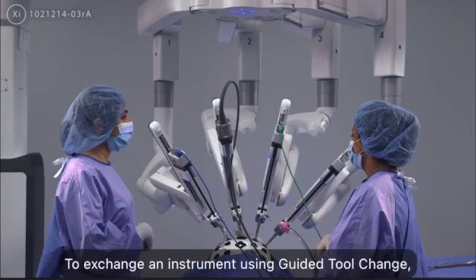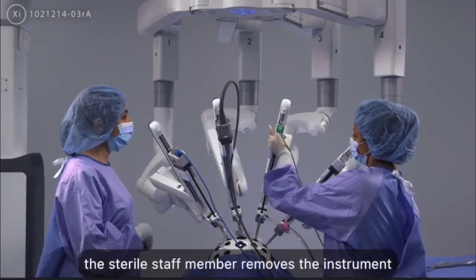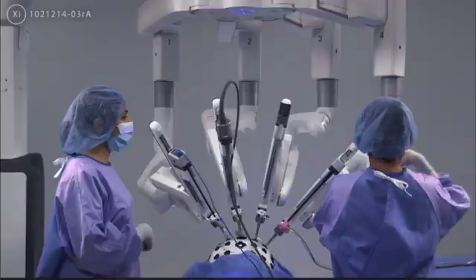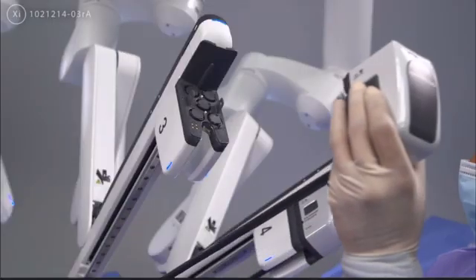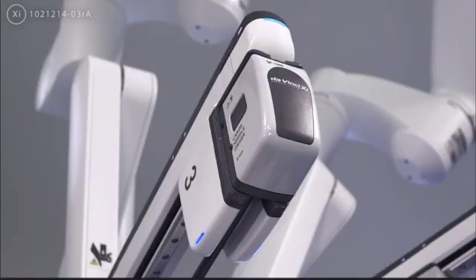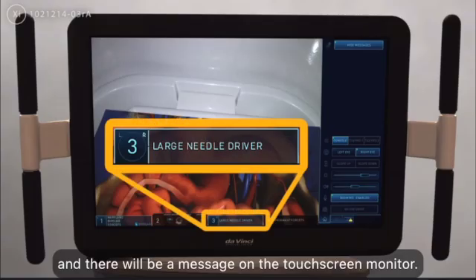To exchange an instrument using guided tool change, the sterile staff member removes the instrument and installs a new instrument on the arm. Note that the LEDs begin blinking green and there will be a message on the touchscreen monitor.